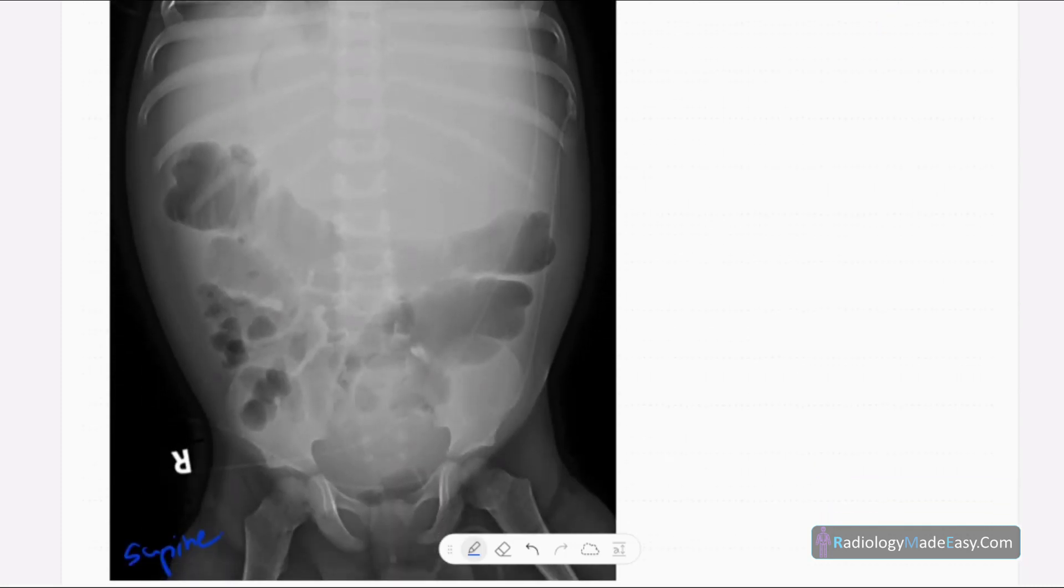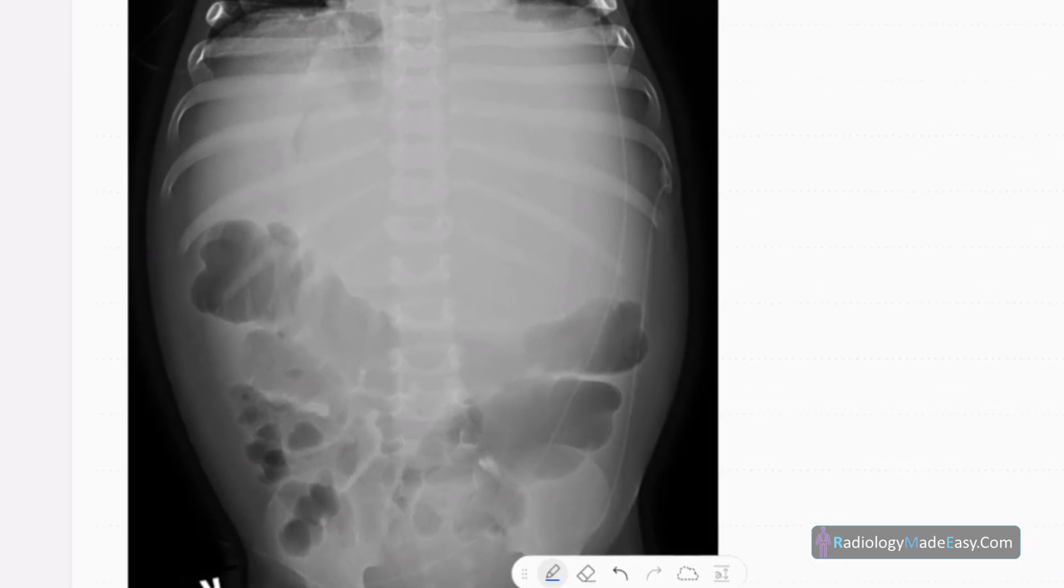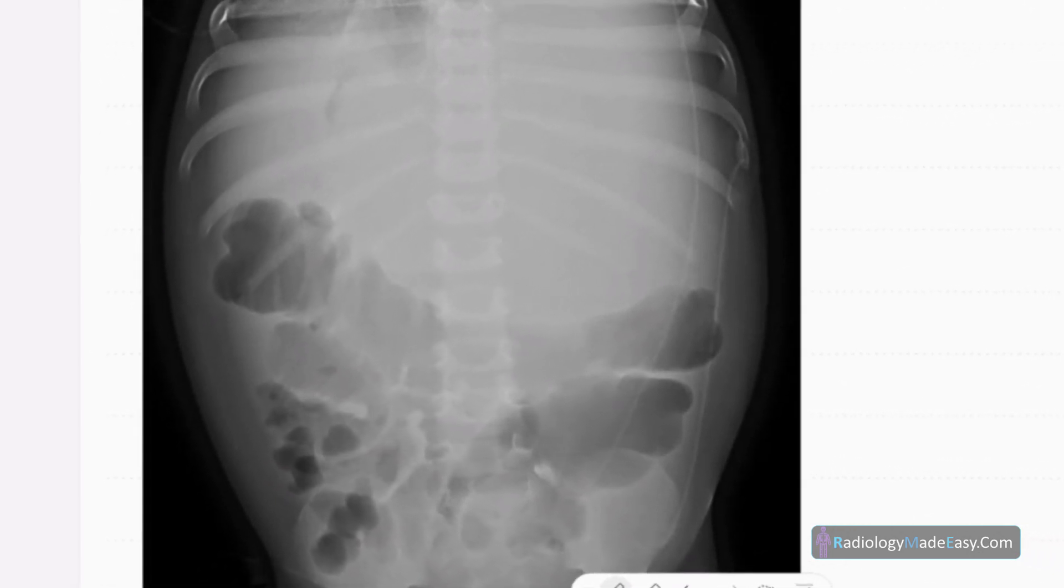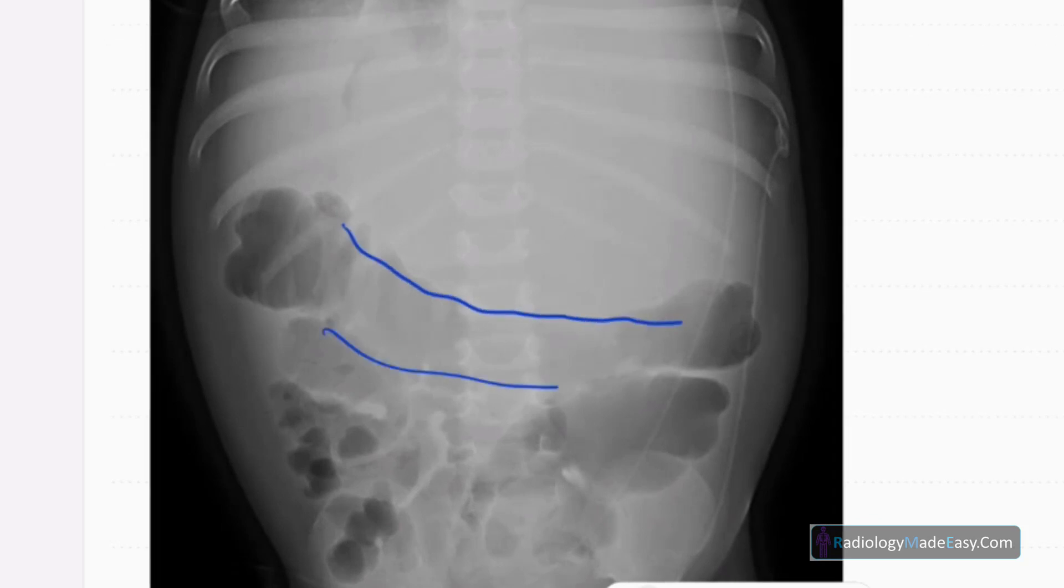So this is the anterior posterior radiograph of the abdomen in this pediatric patient, which is a supine x-ray. When you see closely, you can see displacement of the transverse colon here. It is displaced inferior, it's not in the normal position.